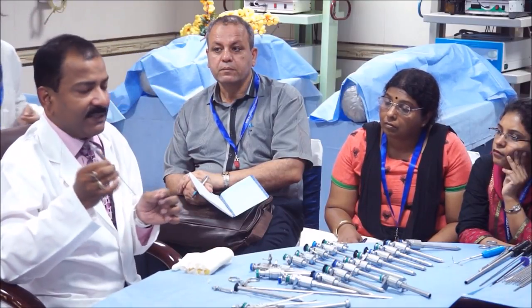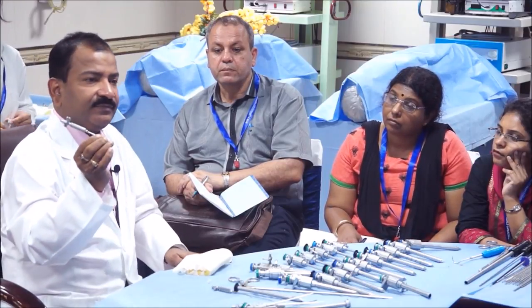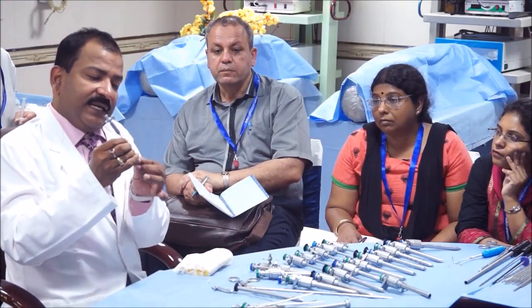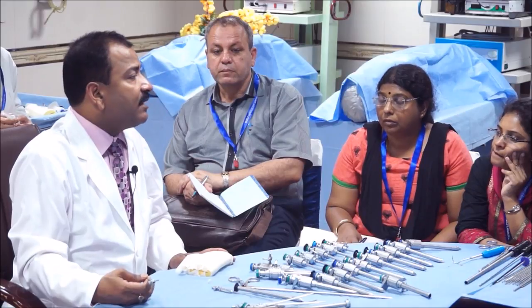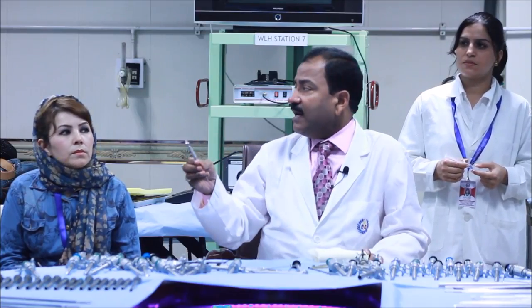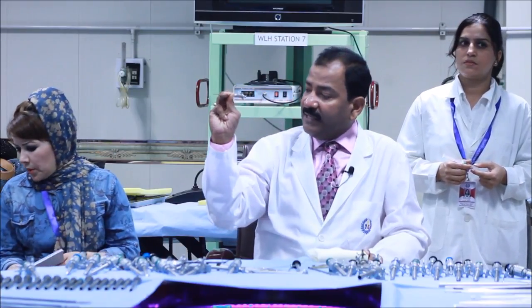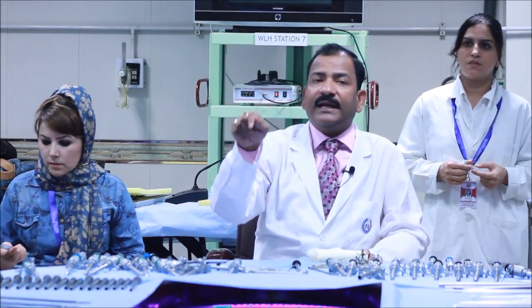Suppose this is pediatric patient and that much thin, then I have to hold it here if I am using it in a very thin patient. So, how much you will keep the tip of the needle free depends upon the thickness of the abdominal wall, 4 centimeter plus thickness of the abdominal wall. And then you will hold like a dart. Dart is a game which is used to throw. If you have to aim, you are using dart, and dart always they hold it like a pencil this way. If you will hold like that, you cannot throw it, you cannot get an aim.